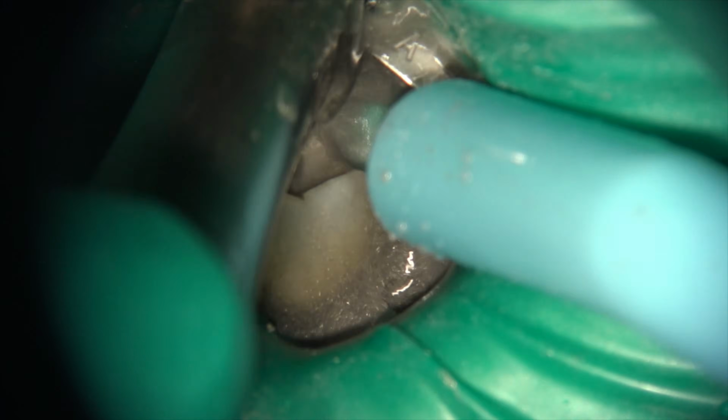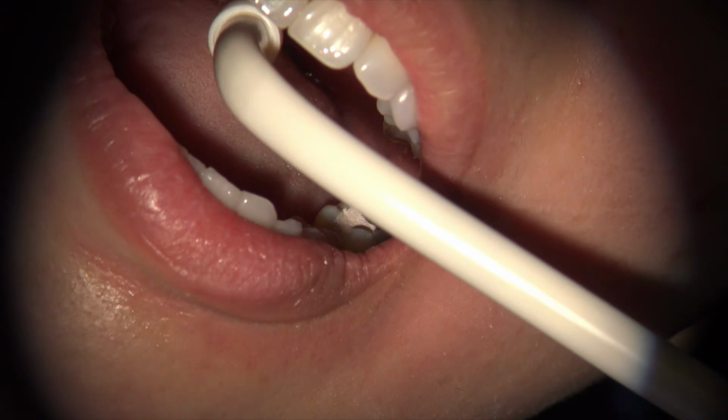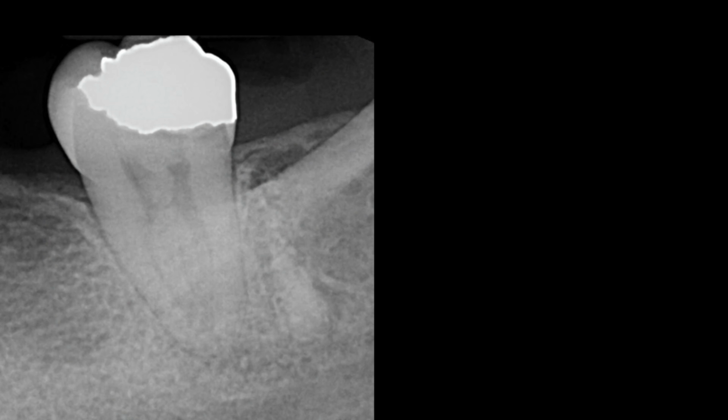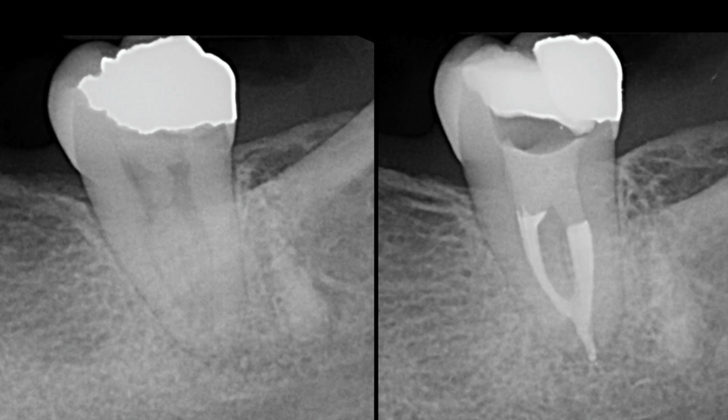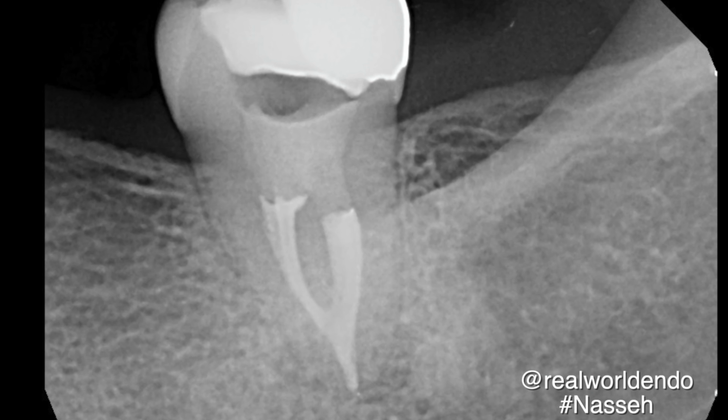Once again, I want to emphasize that the patient should not be feeling the shot at this point because the tooth is already numb with the conventional shot. This is insurance anesthesia, and we go on and do the root canal procedure. It's hydraulic condensation in this somewhat C-shaped canal. As you can see, we finished the root canal and placed the BC liner on top and a little bit of Teflon, followed by CAVIT, and the patient's off to get the tooth restored.